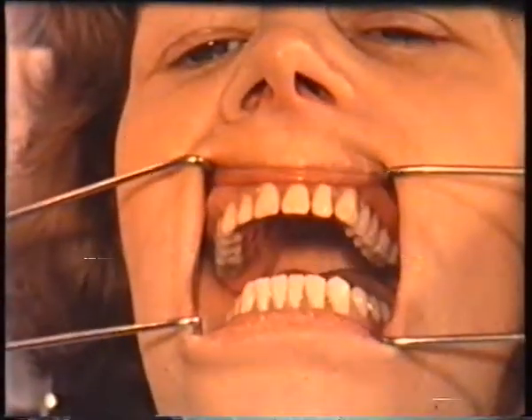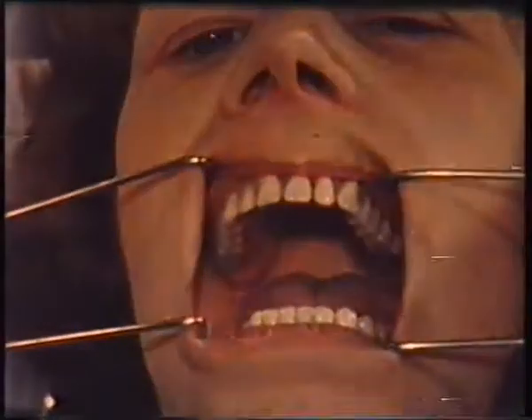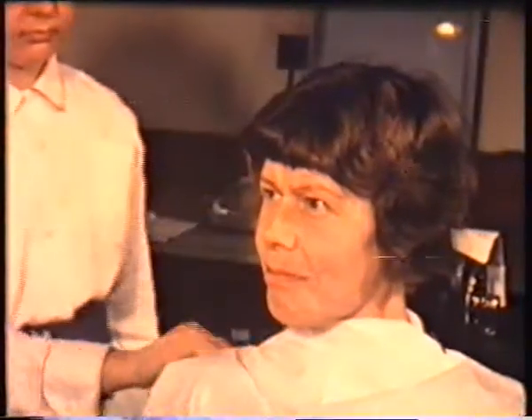No check on occlusion, however, can be carried out until the anesthetic tube has been removed and the patient has recovered consciousness. The day after the teeth have been extracted and the alveolectomy performed, the patient must be seen to make sure that she is reasonably comfortable with the dentures, that healing is proceeding normally, and to make any necessary adjustments to the occlusion or peripheries. Both dentures should be removed and the alveolar ridge is examined.